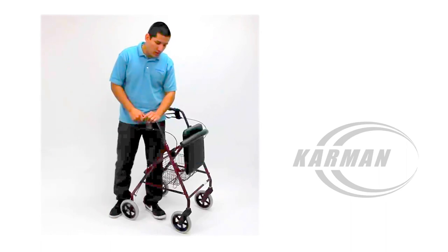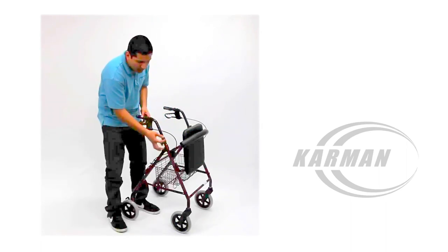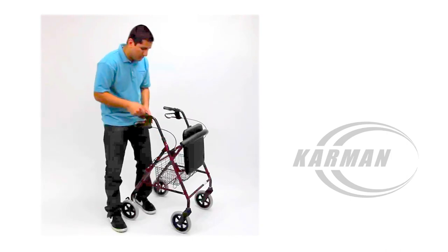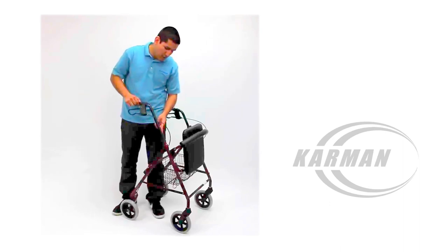This Rollator comes with adjustable handle arms. As you see here, this knob is very easy — loosen it up and you can then adjust your handlebars to any set position.